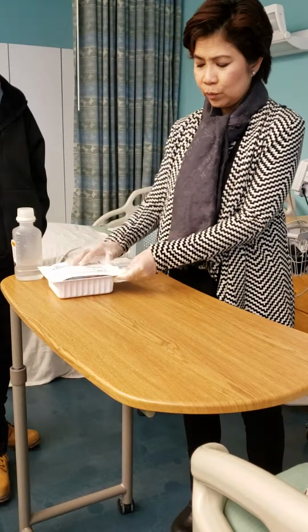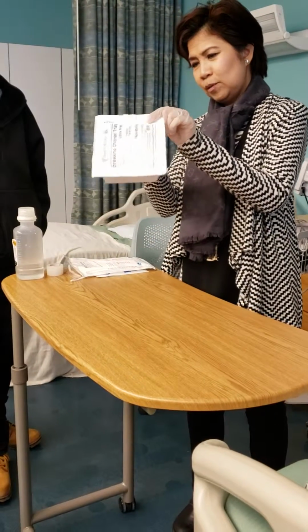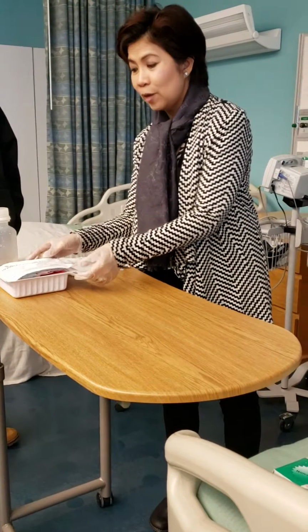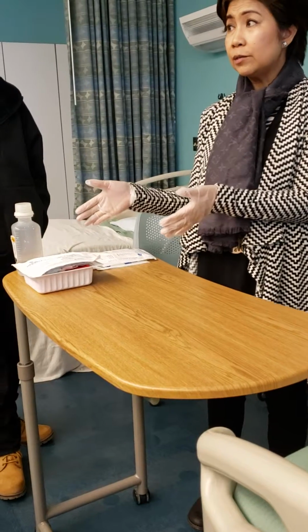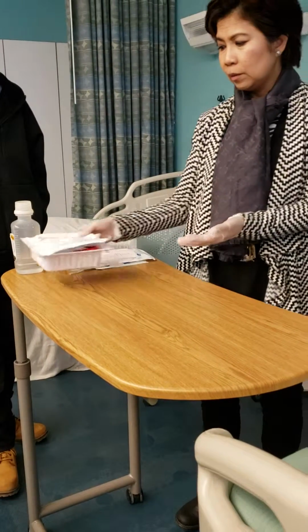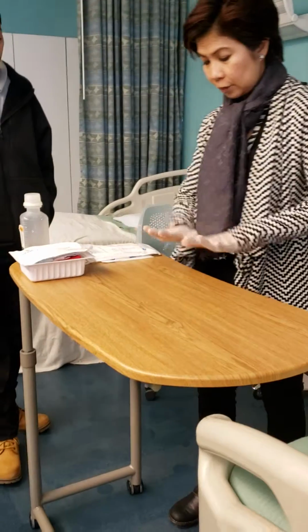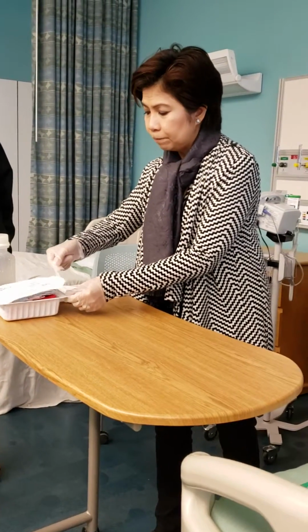If this was new, you open it up by the borders. I taped it so much. Just pretend it's new. Okay. Whenever you have a tray like this, it's sterile on the inside. This one is not sterile because it's resting on some supply room. I just put it there. I already cleaned my work area. It's waist high, and then I open it away from me.